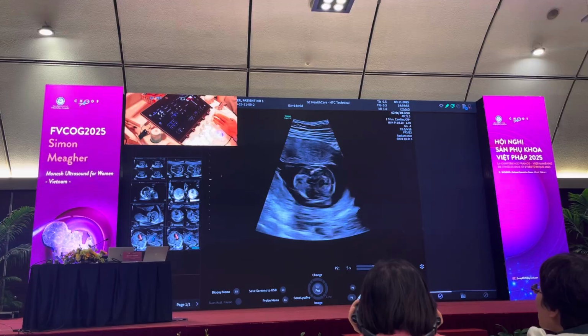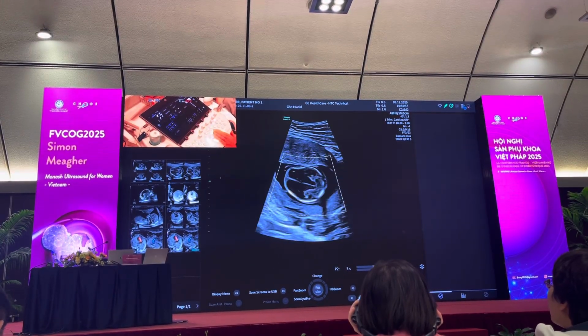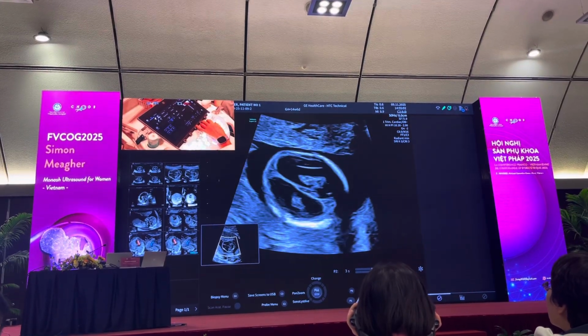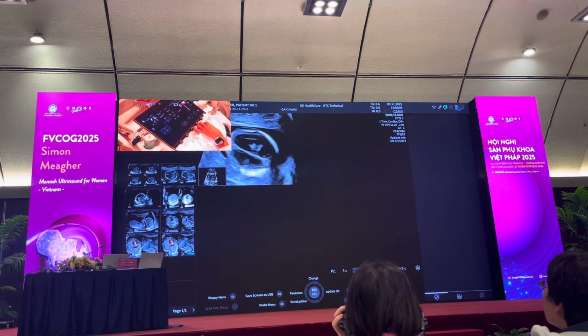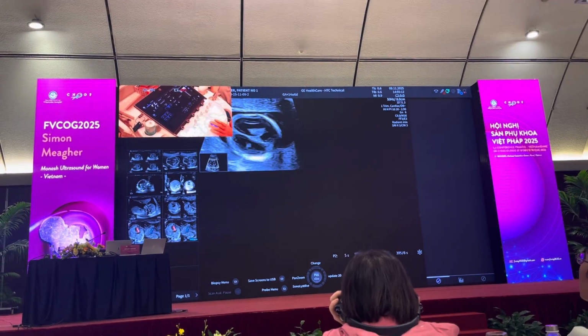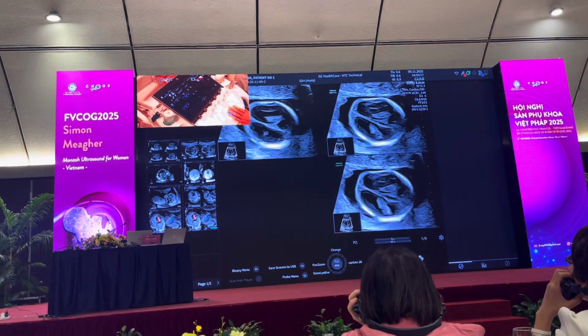So as I come across into a 4-chamber view, I can see that the nuchal fluid looks prominent. The very first section of the brain is just showing the choroids. So I go into a full-quadrant analysis, I magnify the image, and I can see the choroids on both sides. The choroids seem relatively small compared to the size of the lateral ventricles. I then come to the next fluid-filled space, which is the cavum velum interpositum.